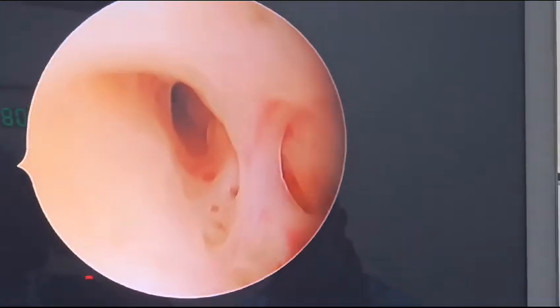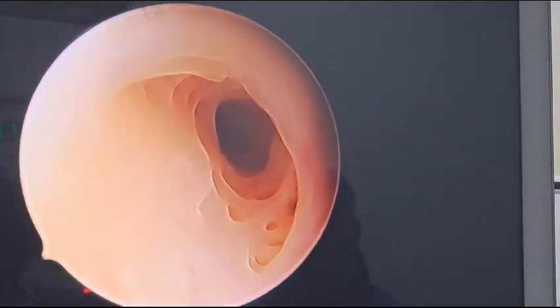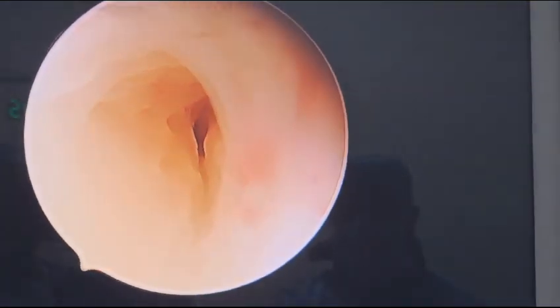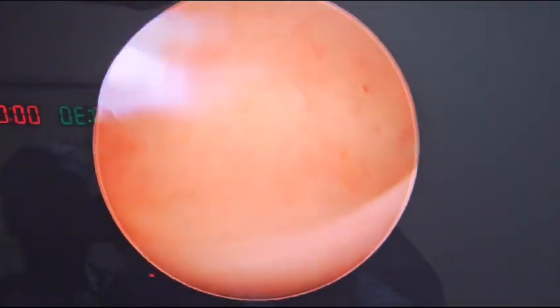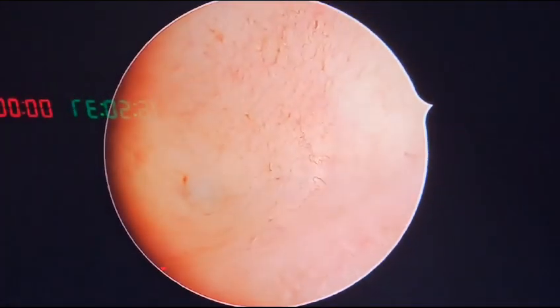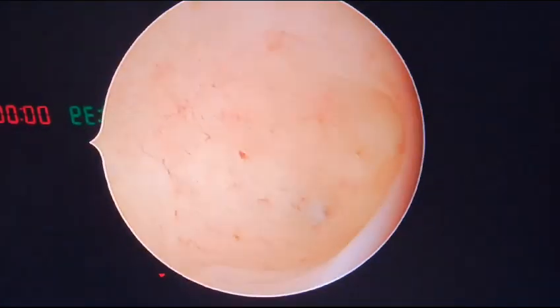So let us see whether internal os will get dilated spontaneously with the help of irrigating fluid. We are negotiating the internal os right now. Yes, slowly just slide the telescope through the internal os. We are sliding. So here the main problem is primary recurrent pregnancy losses. So we are in the endometrial cavity. This is the right ostia, appears closed. This is the left ostia.